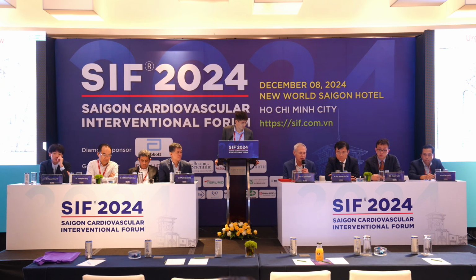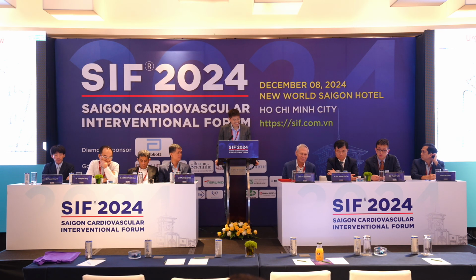But as Quan says, it's always so easy afterwards to comment, but this is probably the problem of the hemodynamic collapse. That's probably the point. You're right. Yeah, maybe you're right. We were just happy that we could fix the RCA occlusion, and when we saw the leakage, it was very tiny. I discussed with Duy Phuong a lot whether to close it or not.